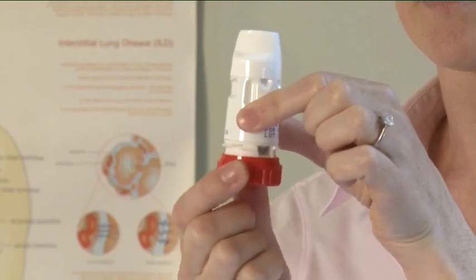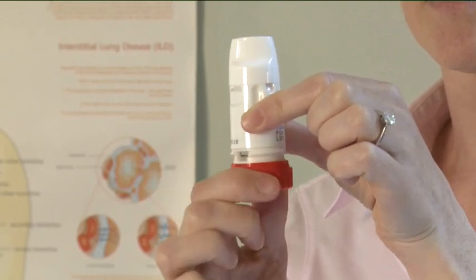You should hear a click sound. Do this again, turning the red grip in both directions. Your Turbohaler is now ready for use.